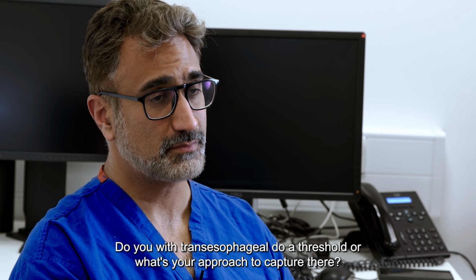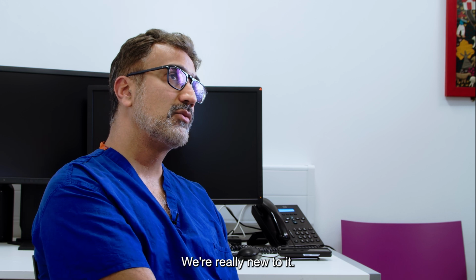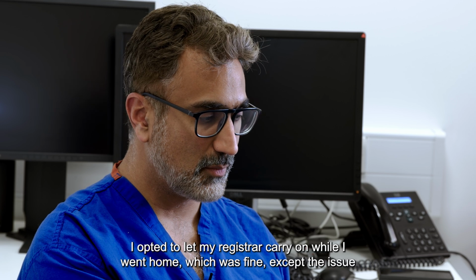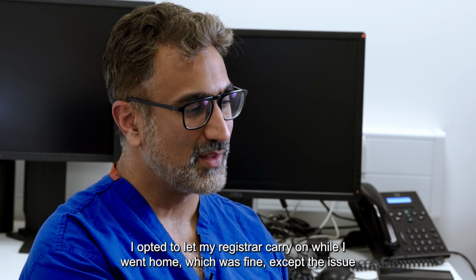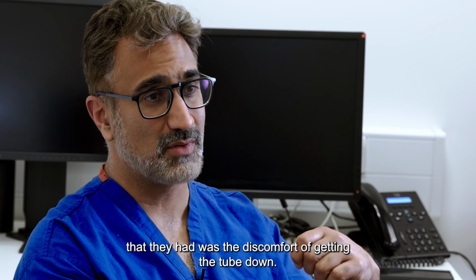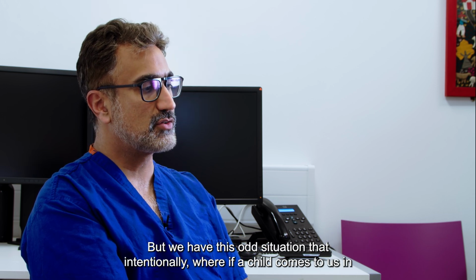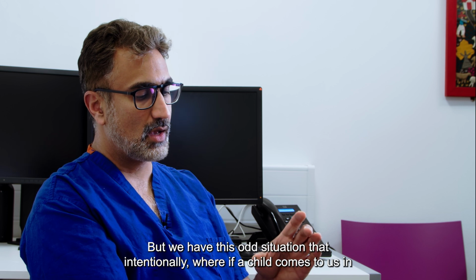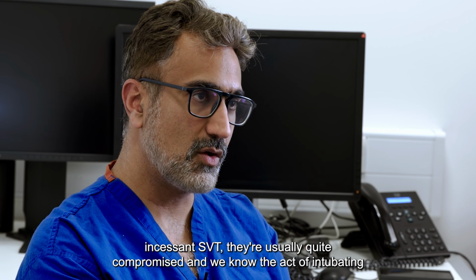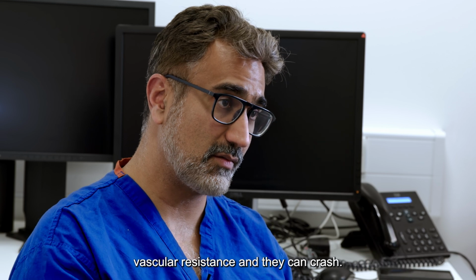Yeah. Do you, with transesophageal, do a threshold or what's your approach to capture there? So really new to it. The last patient we used it on Friday evening, I opted to let my registrar carry on while I went home, which was fine, except the issue that they had was the discomfort of getting the tube down. So, the nurses are super familiar with passing an NG tube, but we have this odd situation that intentionally, if a child comes to us in incessant SVT, they're usually quite compromised. And we know the act of intubating them and putting them onto a ventilator can be quite risky because you drop their vascular resistance and they can crash.